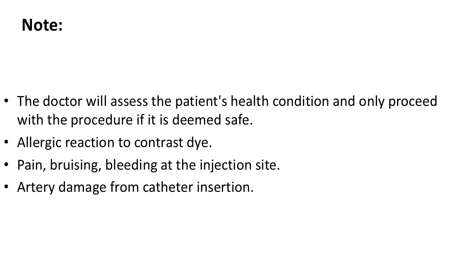Note: the doctor will assess the patient's health condition and only proceed with the procedure if it is deemed safe. Allergic reaction to contrast dye. Pain, bruising, bleeding at the injection site. Artery damage from catheter insertion.